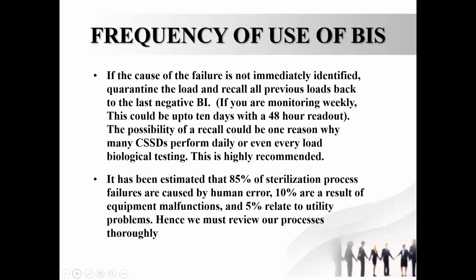This is very, very important. So how often should you use BIs?